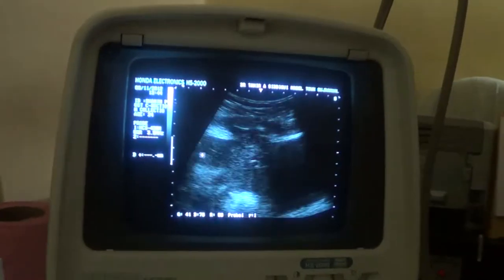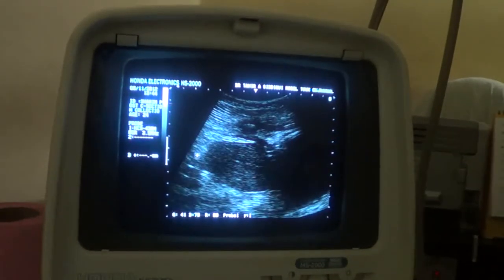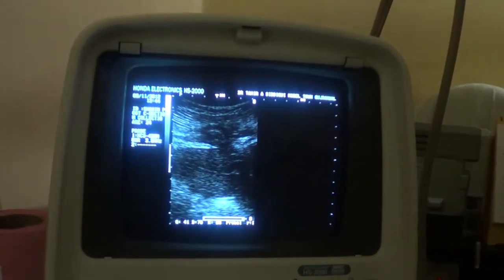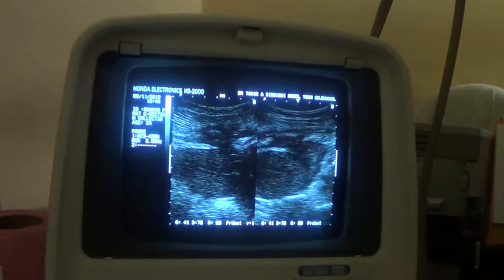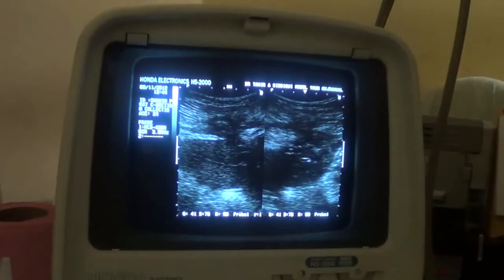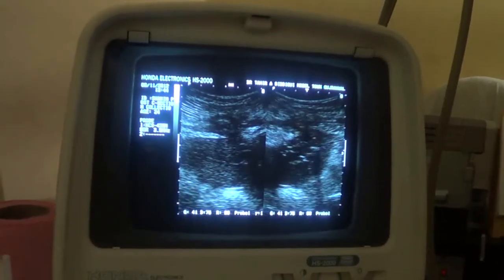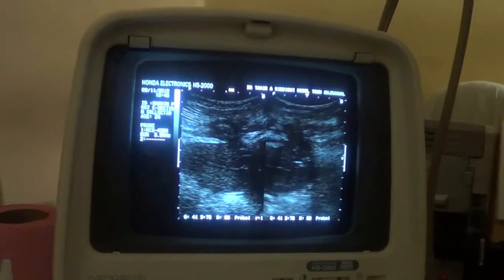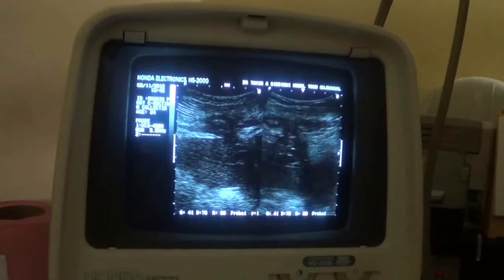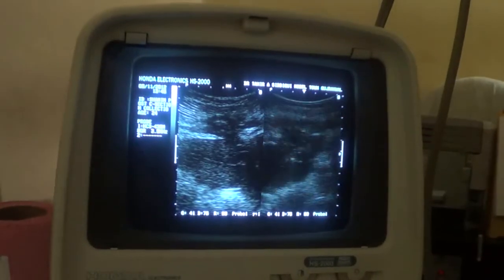So this is a case of subcutaneous collection due to a breach in the anterior wall of the uterus post cesarean section, only 18 millimeters deep from the skin, making a track into the subcutaneous tissue with multiple echogenicities seen within it.